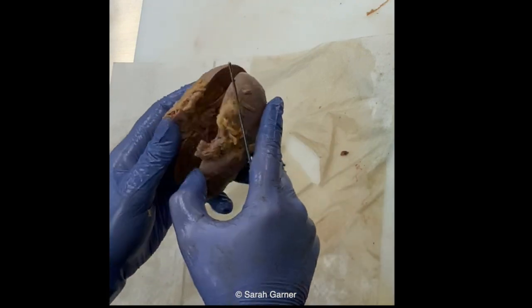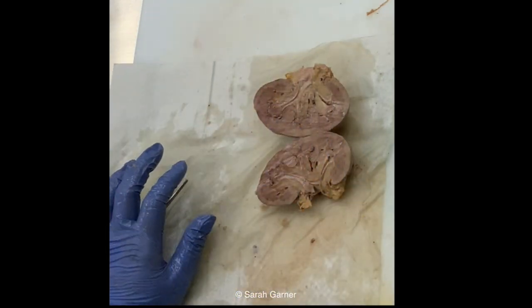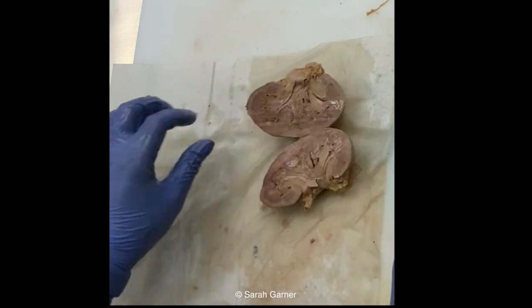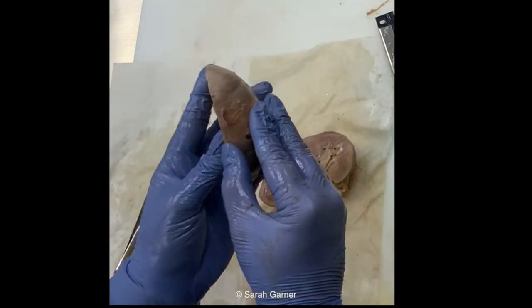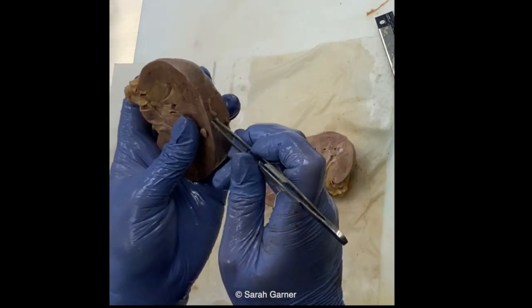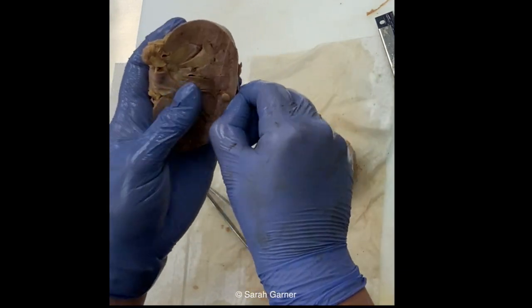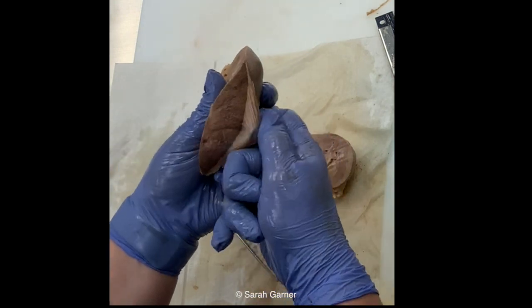So you need to look at as much surface area of these organs as you can, because there could be a tumor or a cyst or something in here that you're not seeing, because look how thick it is, right? So at this point, this is when I usually like to peel off the capsule. You can do it before you bivalve, you can do it after, it doesn't really matter. I personally think it's a little bit easier once you've already cut, because you have a cut surface here and you have something to peel off.